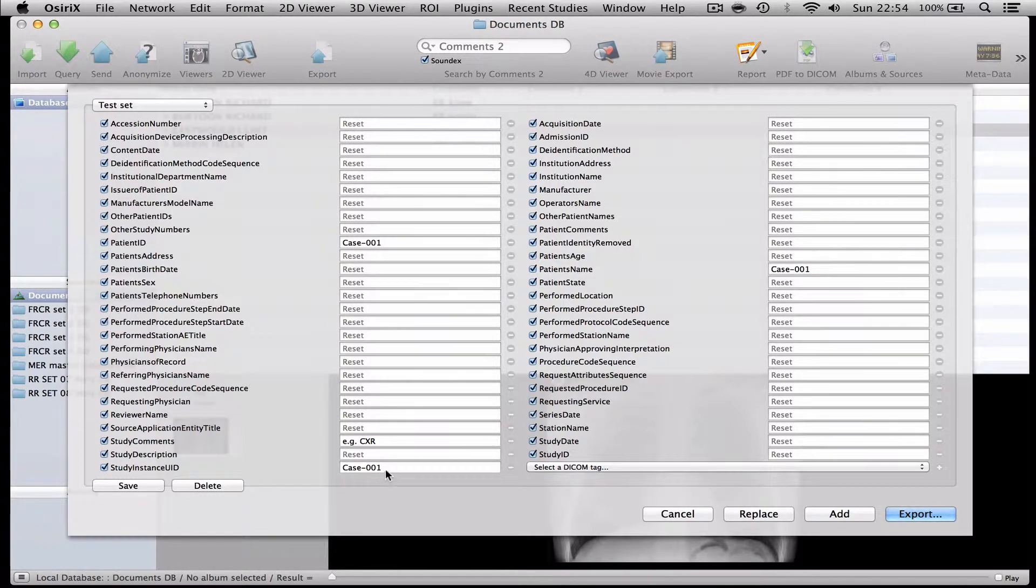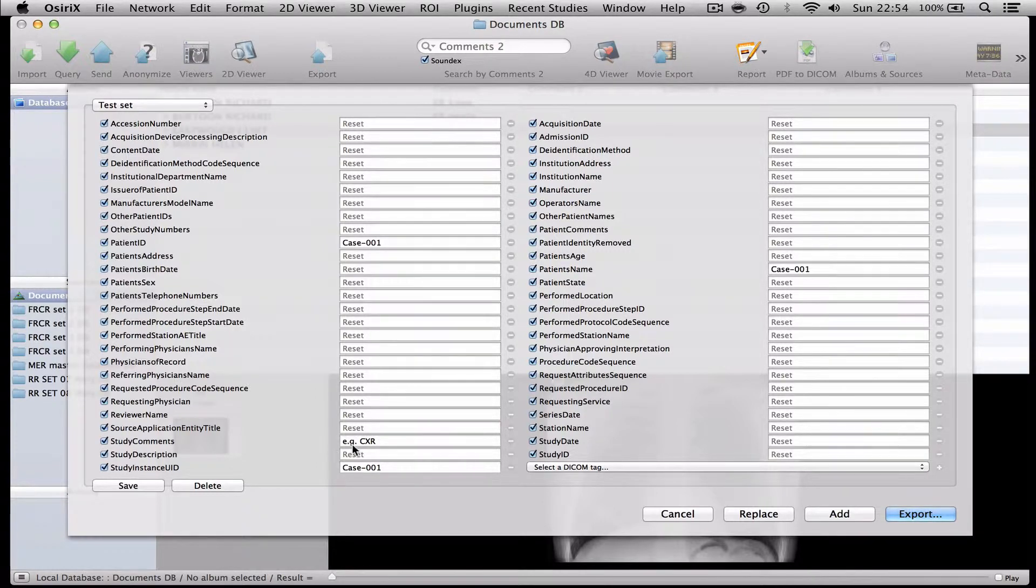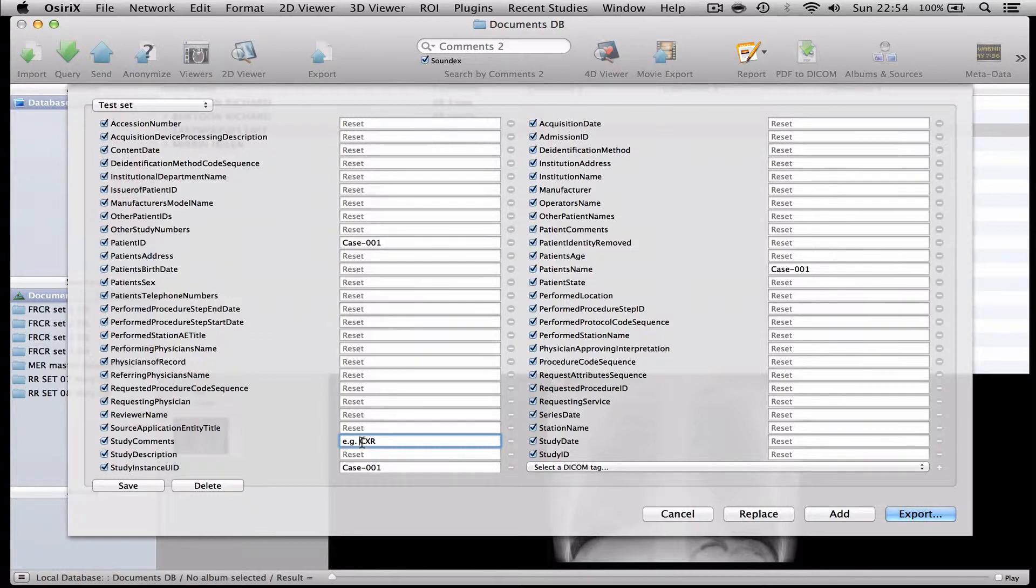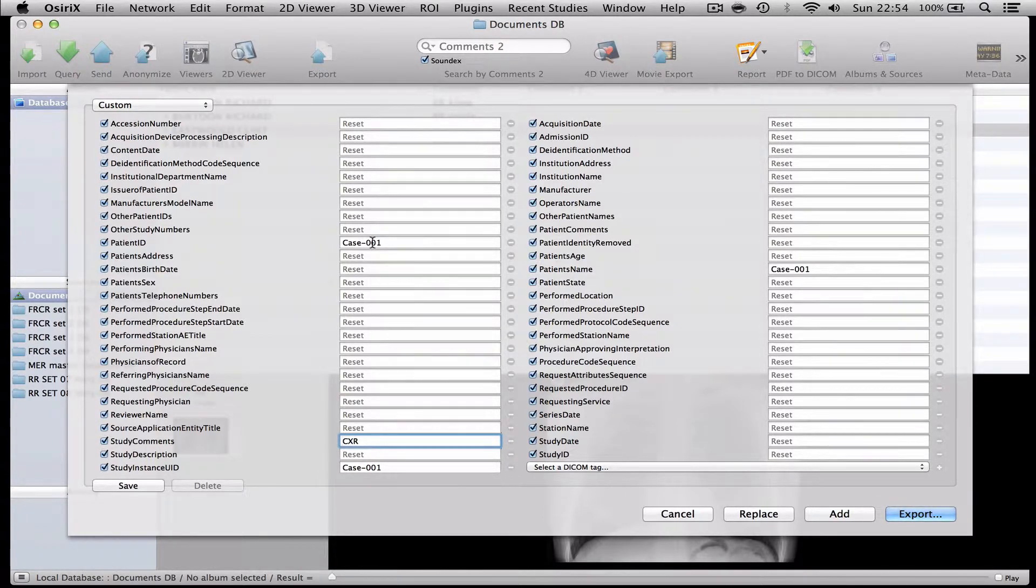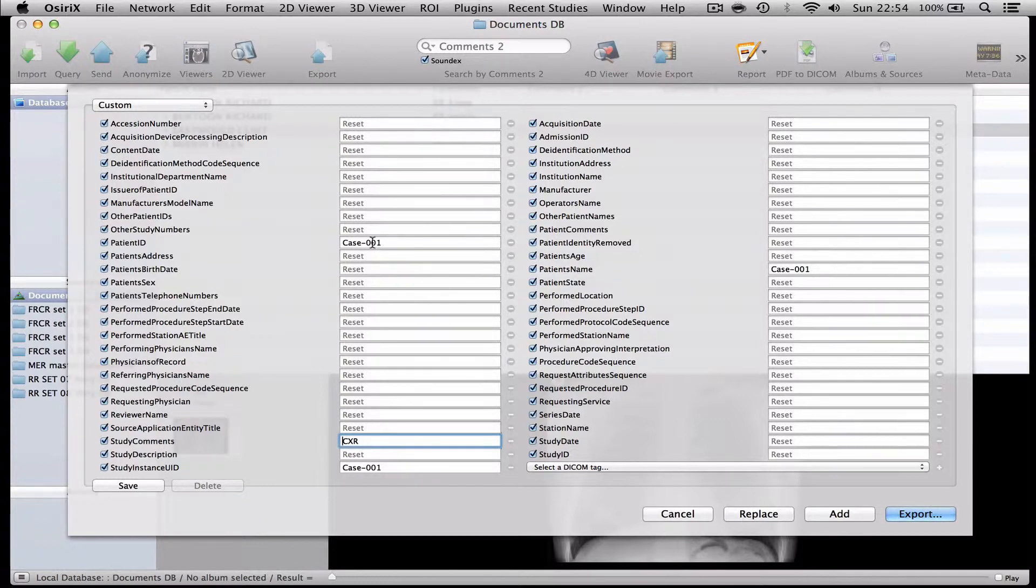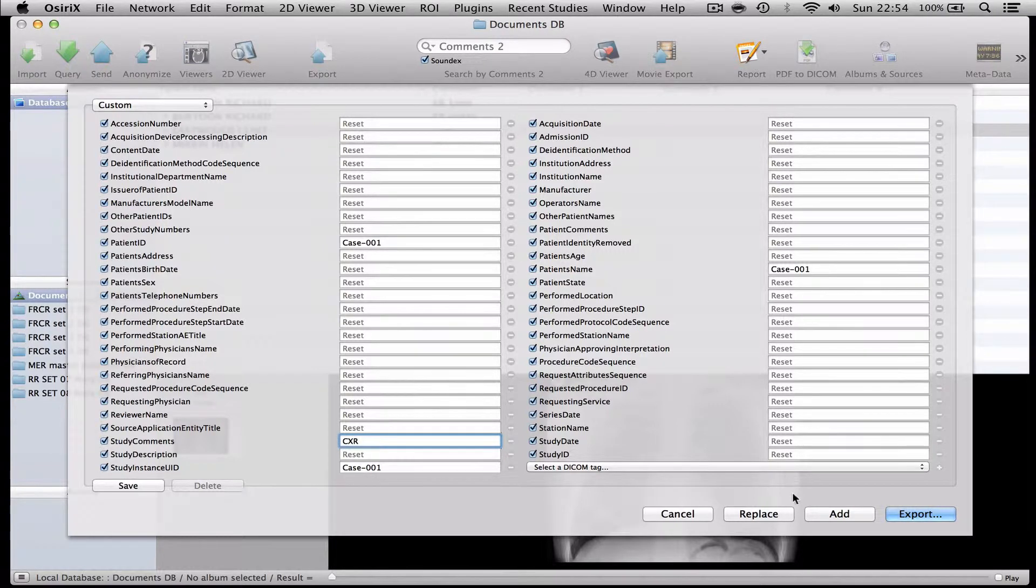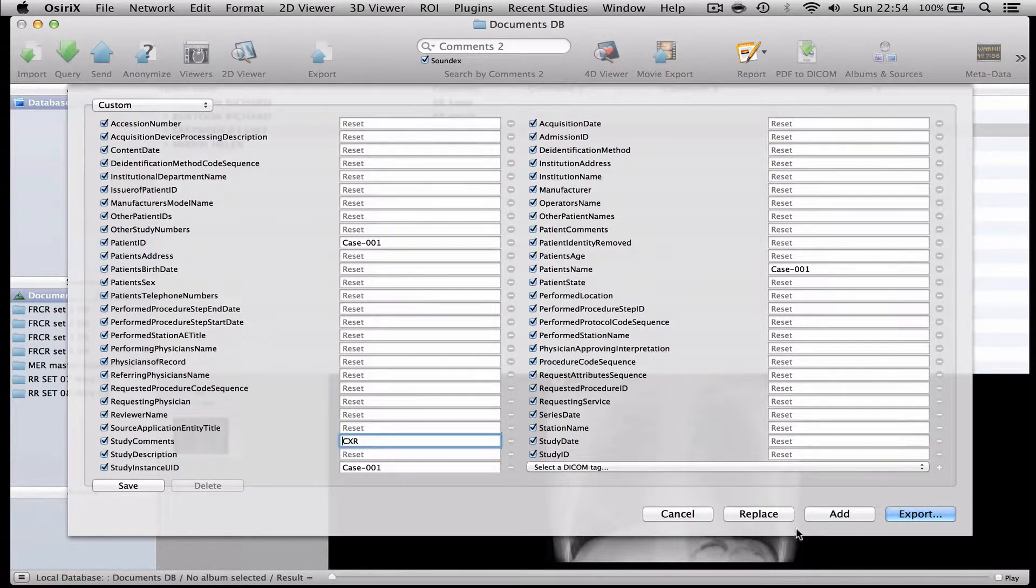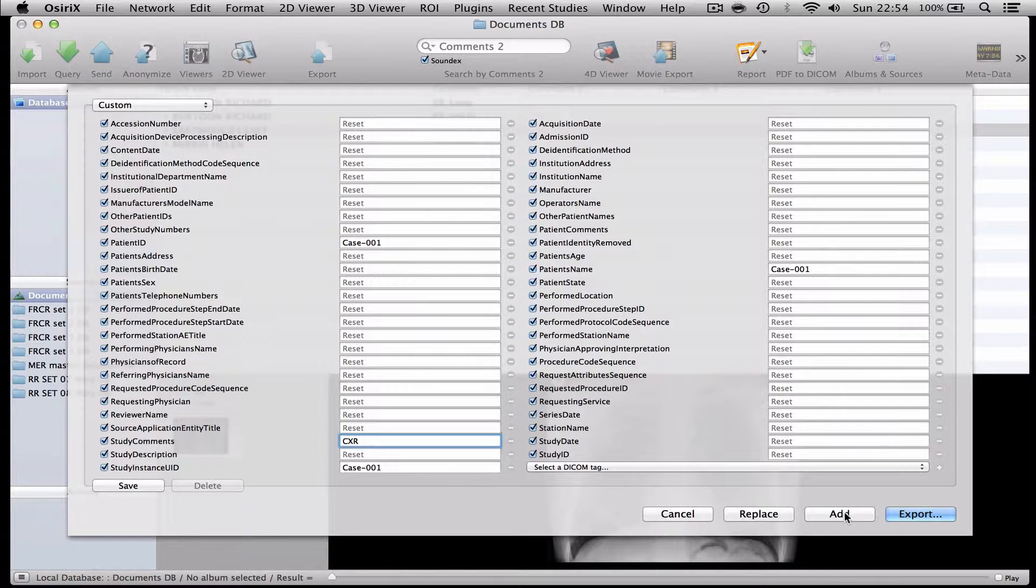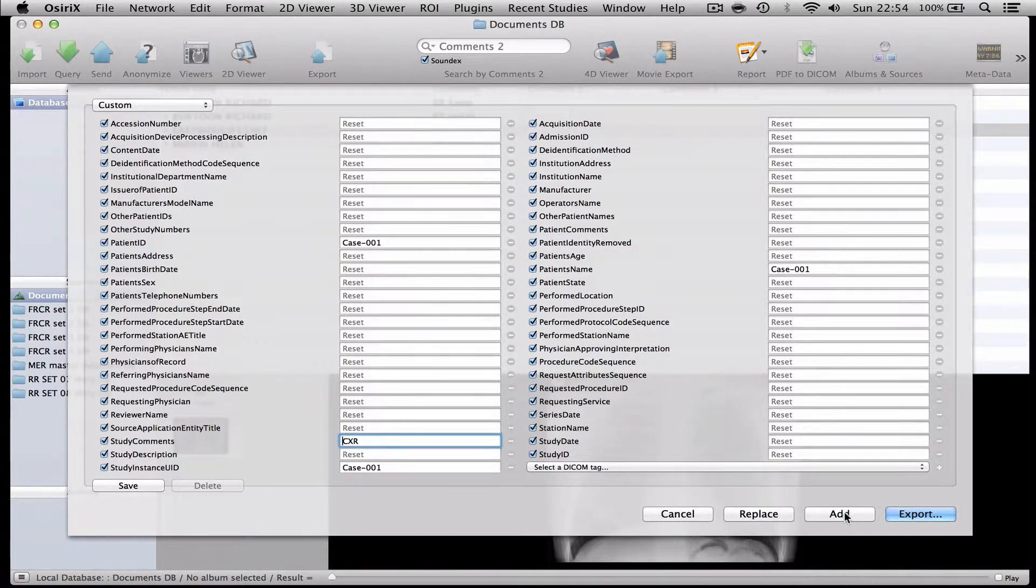And I've also got the option here to change the name of the examination. Now in this case we know we're looking at a chest radiograph so I'll just change that to CXR. I'll keep these the same because this will be good to be sent as case one of the cases that I'm sending to my friend. And I now have the option of either replacing the original case with an anonymised version or adding an anonymised version to the original unanonymised data set and I always choose to do the latter.